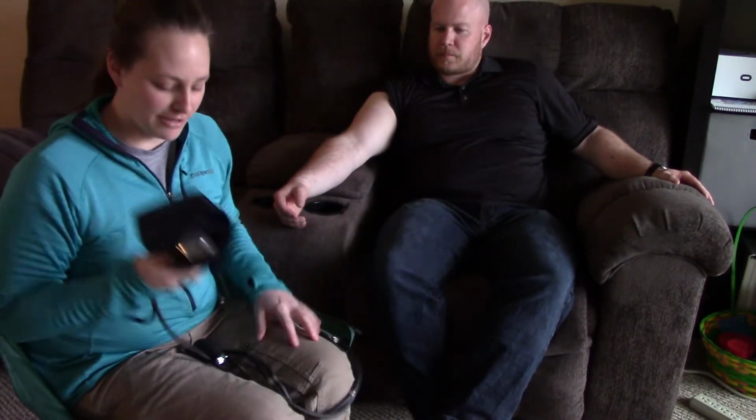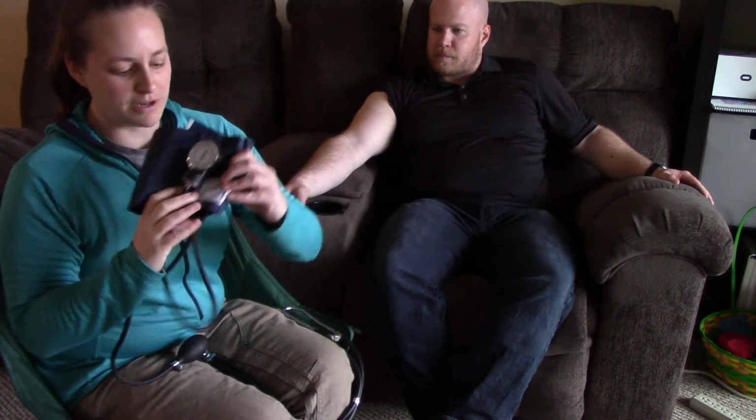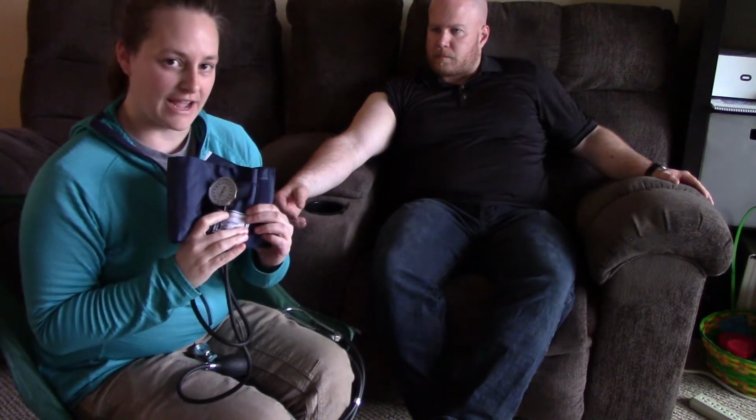Alright, so we're ready to check Brandon's blood pressure here. The first thing I'm going to do is get the cuff situated correctly. I'm going to be checking the blood pressure on his right arm. So usually your blood pressure cuff will have some arrows that will tell you right arm or left arm. And then we want this arrow to be pointing at the artery.